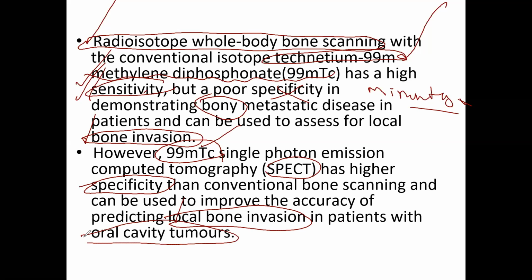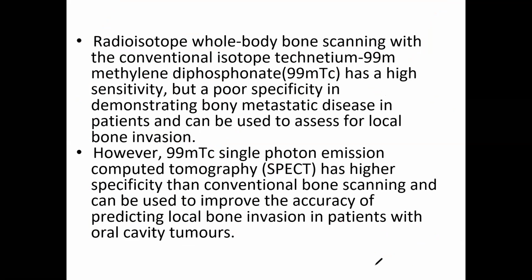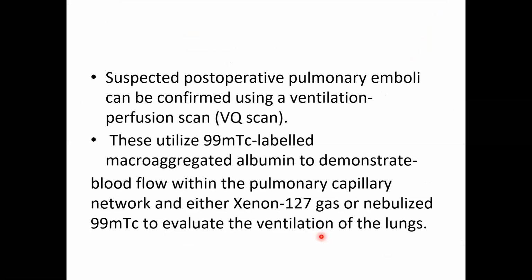So the technetium 99m SPECT scan is helpful for these oral cavity tumors. That is one thing which is very important. So, technetium 99m SPECT scan.